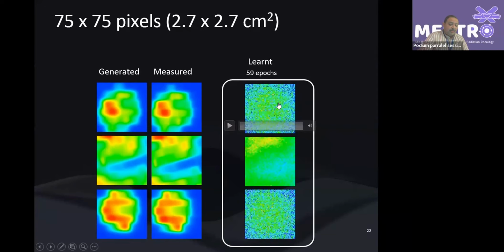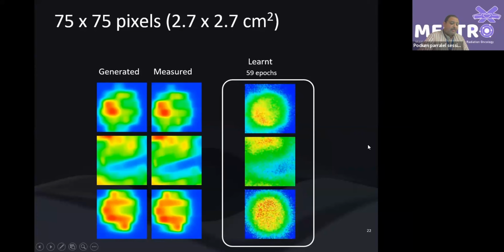Now, these are the images after 60 epochs. This is 12 days of training, and we still only managed to do 60 epochs. But the results are promising. We're seeing that, if we left it to run more, then it's going to be fine. All of these calculations are done on a CPU.